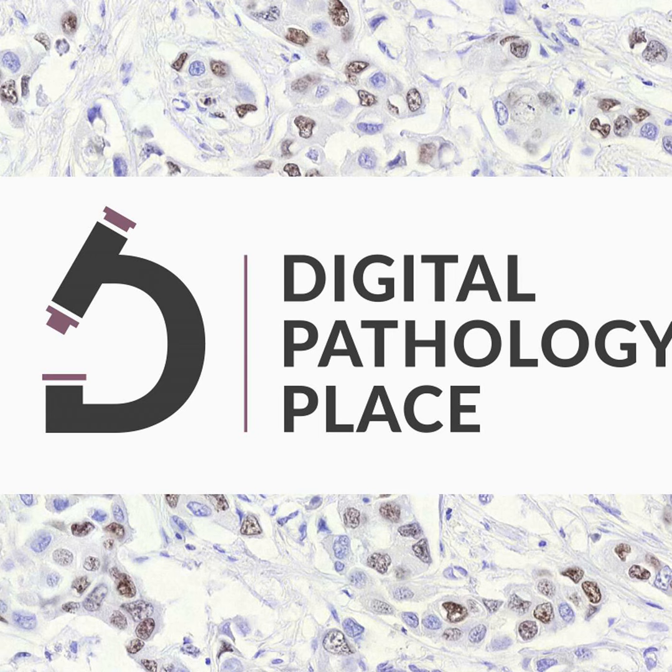So thank you so much for presenting this to us and for pointing this out to the listeners. I think this is really important, and something that's underestimated. The thing you mentioned, that pathologists visually normalize the scores, so often they are higher than the pixel count. I don't think we're always aware of that, and then there can be misunderstanding about whether the model is not matching the ground truth. If our ground truth is annotations, it's a different story, but if our ground truth is scoring, that's another problem.